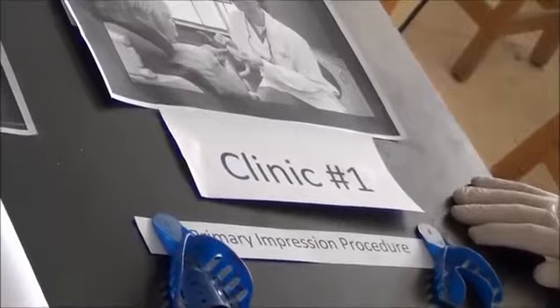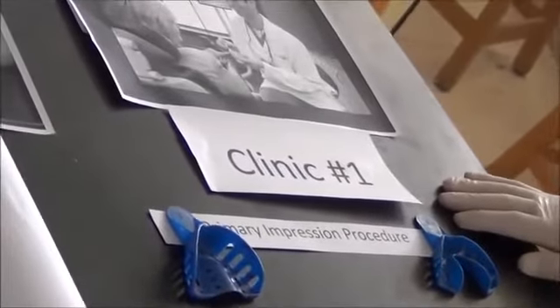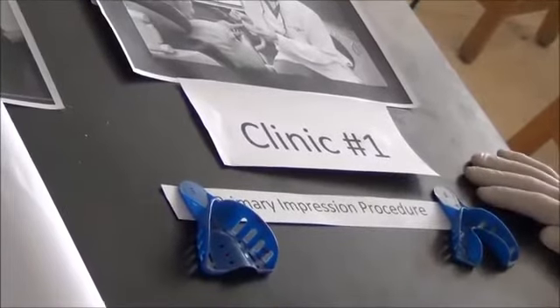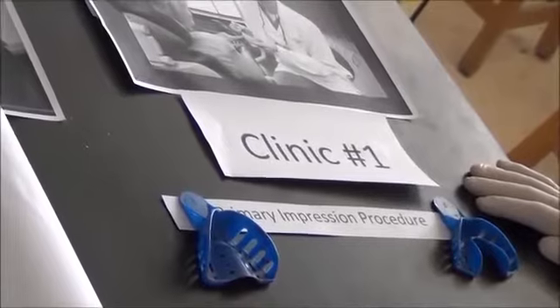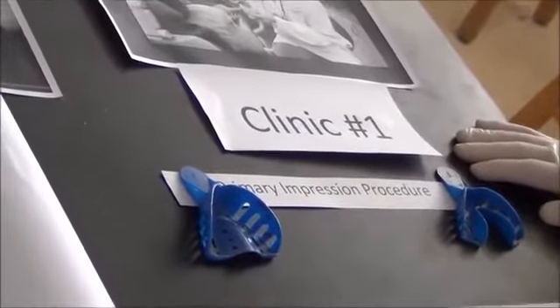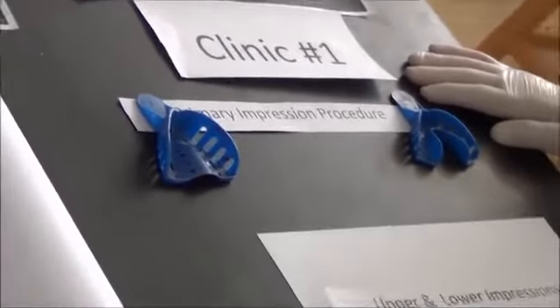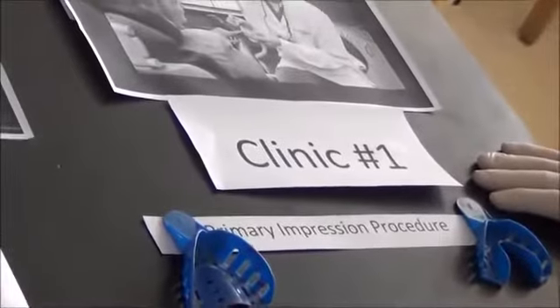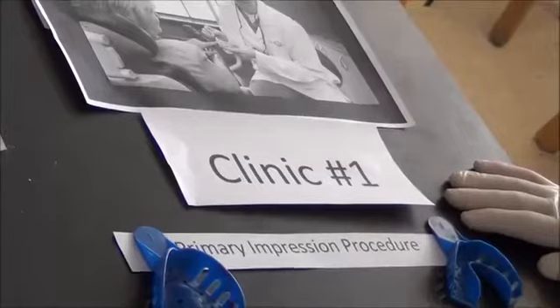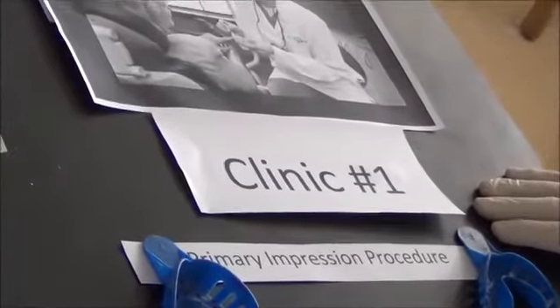If we begin at clinic number 1, the dentist has decided that this patient is suitable for a chrome cobalt RPD. Remind you that chrome cobalt is a definitive treatment, meaning that the patient should have finished all of the procedures before it, stabilizing his oral health, removing teeth that should be extracted, treating his periodontal diseases if he has any, and treating active dental caries. So chrome cobalt is a definitive procedure. So all of the dental procedures prior to that are not counted here. We are talking about clinic number 1 of the actual RPD procedure.